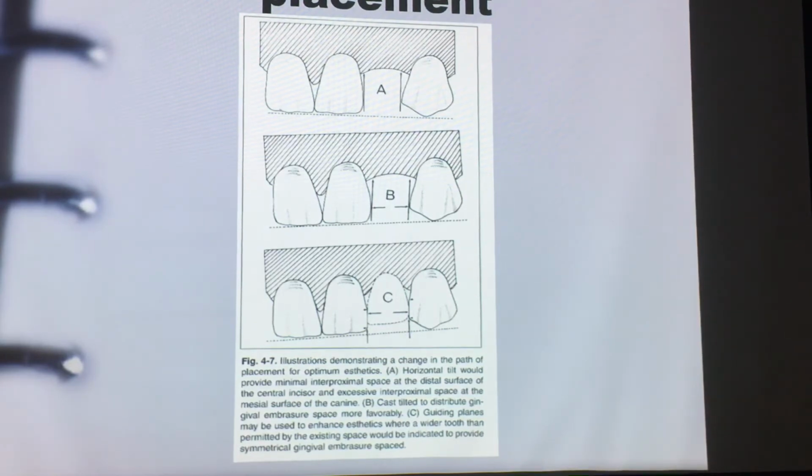If you see the space here near the cervical third of 2.1 and the mesial third of 2.3, there's a space here. And this undercut can't be utilized with plastic or acrylic or teeth, because therefore the denture will not go in and the denture will not come out.